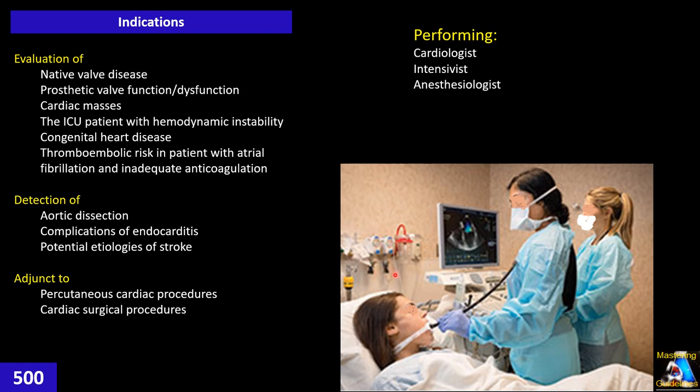Anesthesiologists usually do it from the head, under the guidance of the laryngoscope, which is more accurate in cases where insertion of the probe is very challenging. With that technique, we can insert easily.